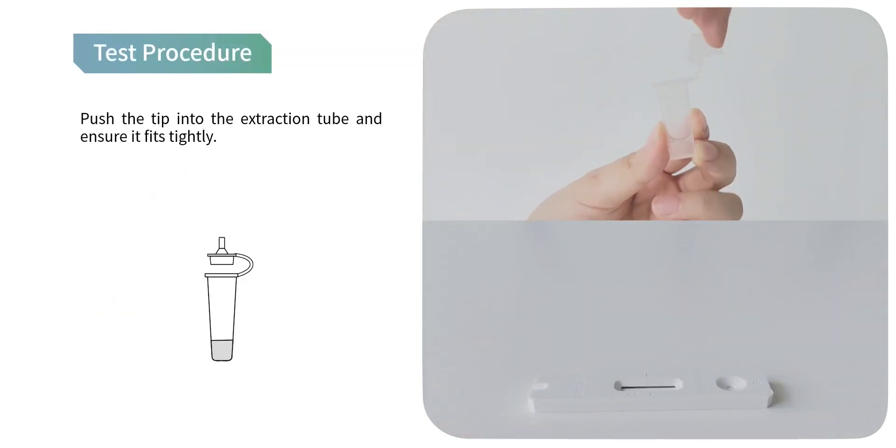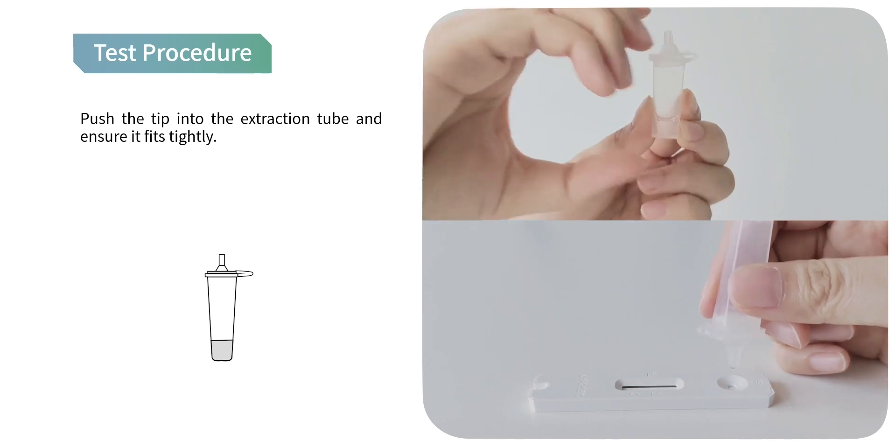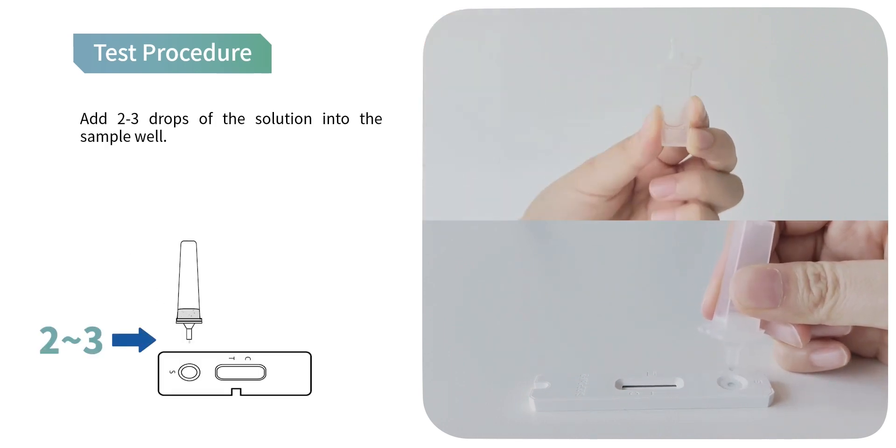Test procedure: push the tip into the extraction tube and ensure it fits tightly, then add 2 to 3 drops of the solution into the sample well.